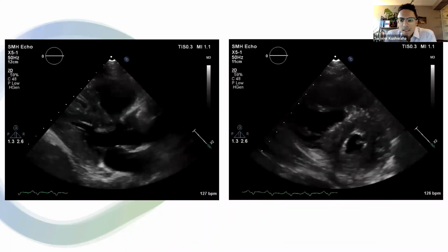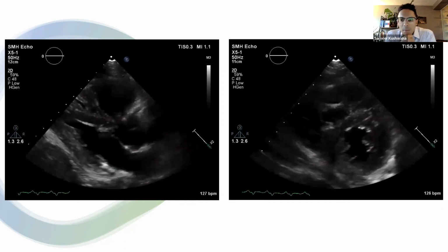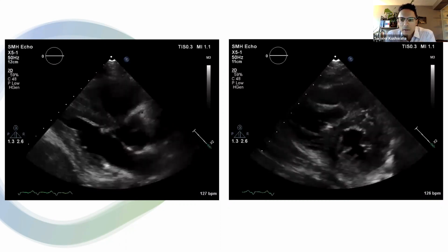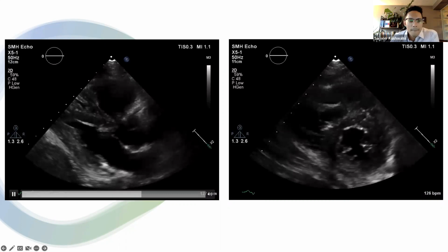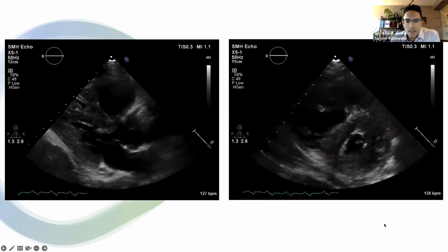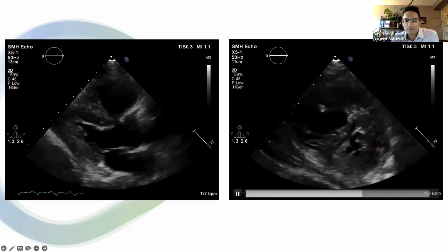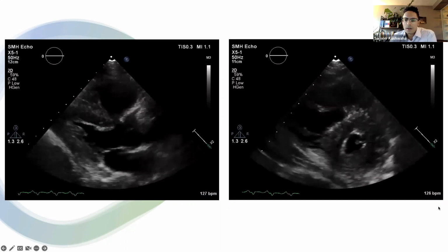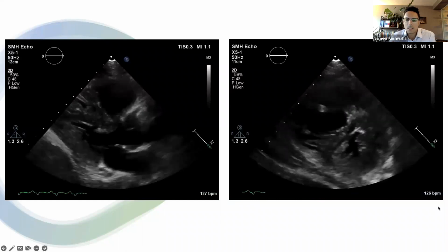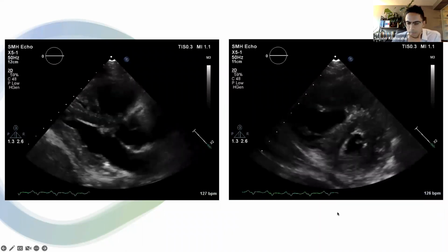So on the left, we have a parasternal long axis view showing a somewhat small left ventricular cavity. We can see an enlarged right ventricle at the top of the image. And on the right picture, looking at the parasternal short axis, we can see that the right ventricle is grossly enlarged. And there is septal bowing towards the LV, forming this classic D-shaped septum, suggestive of volume and pressure overload. The patient is also quite tachycardic here.